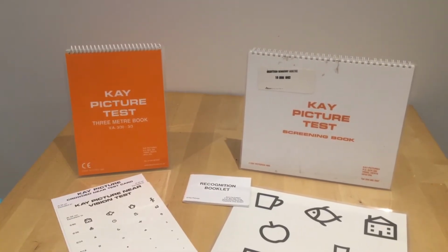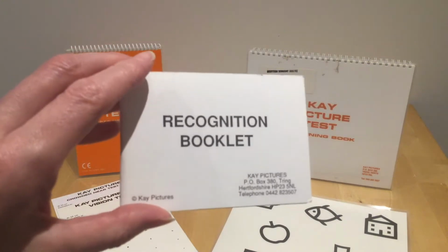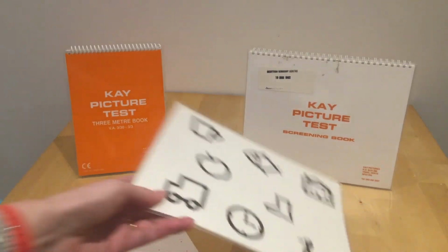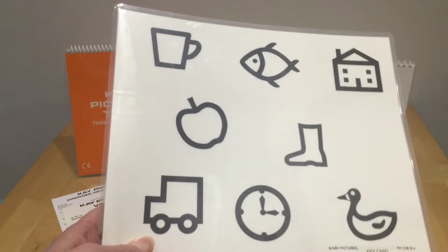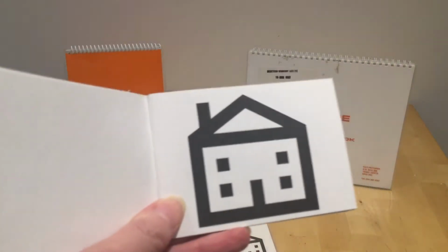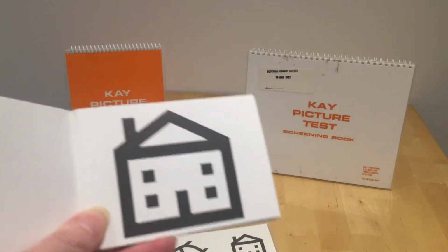The next assessment I'm going to look at is the Kay Picture test. It's very often used with young children. This is because it contains many familiar elements to a young child. Let's start off by looking at this recognition booklet. And you can use this in conjunction with this key card, which can be used throughout the assessment. So with the key card or with this recognition book alone, you would ask the child to name the picture or to match it to the key card.